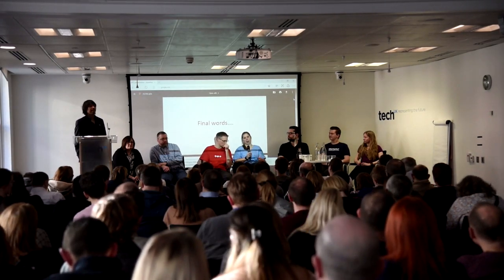It also depends. Some people will run a little bit below their target on average. Some people run higher. So depending on their lifestyle and their needs, people will adjust it a bit. And based on that, they can use that to tune their outcomes of where they want to spend most of their time in range, and if they have problems, where they want to improve from there.